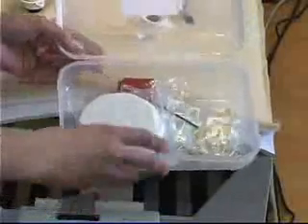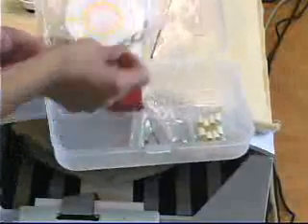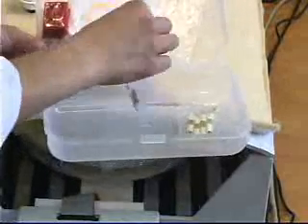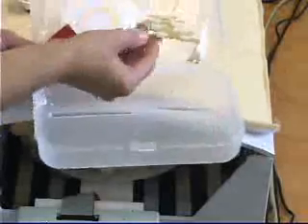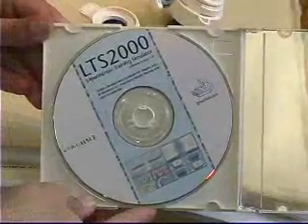The LTS2000 system comes with an accessory pack which includes 100 cutting circles, 3 cannulation rods, although only one is shown here, 5 O-rings or conductive rings, 3 stitch patches, 15 pegs, and 6 cinching tubes. The system also comes complete with an LTS2000 interactive software for PC.